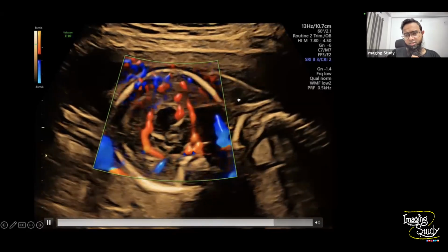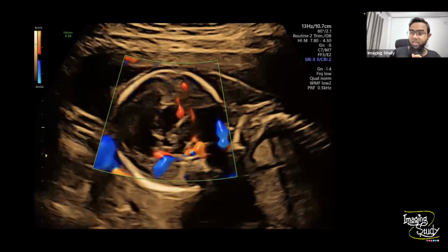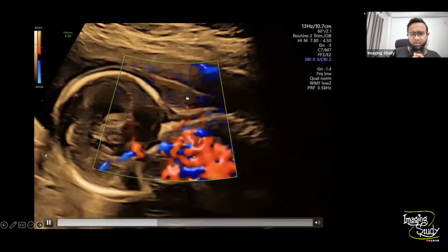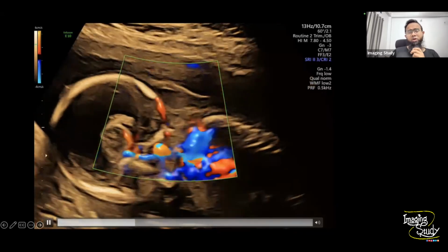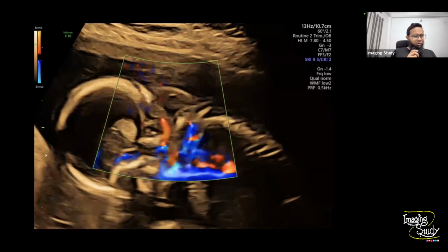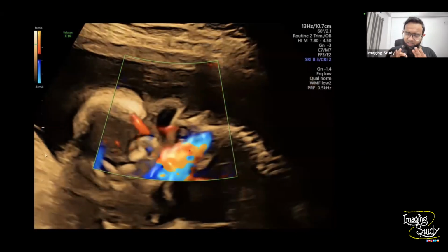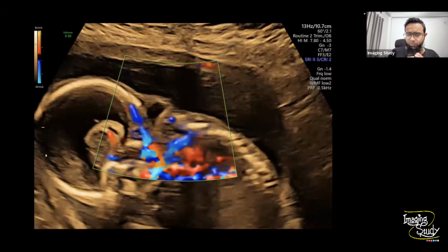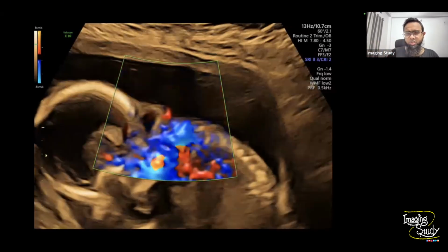Here's the skin thickening, which is also associated with cystic hygroma. Okay, this is the cystic hygroma. You see that we put the color Doppler and there was no vascularity here. So this cystic space is the cystic hygroma. Whenever you see a cystic hygroma, you should make some points. You may get hydrops fetalis or whatever. To make it very easy: if you see cystic hygroma, you first think of Turner syndrome, which is a very common association. But you will see some renal defect in such patients.